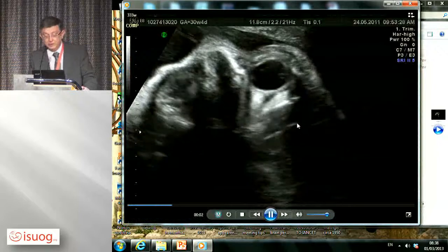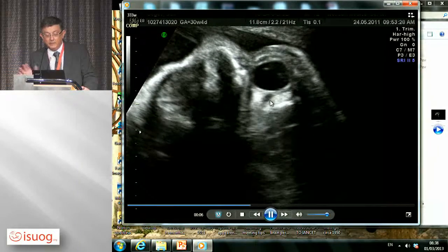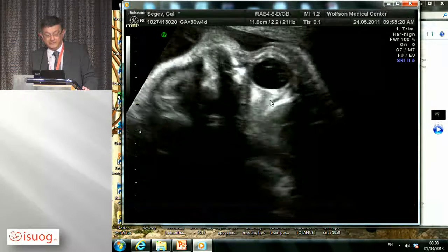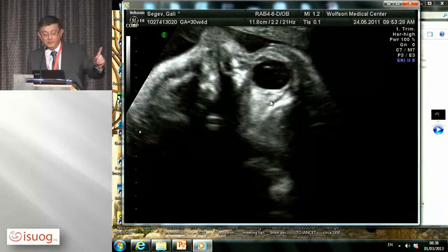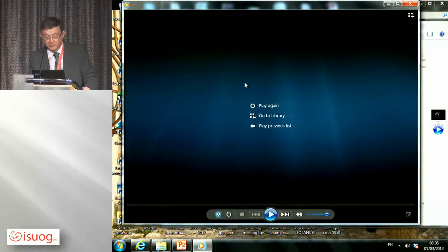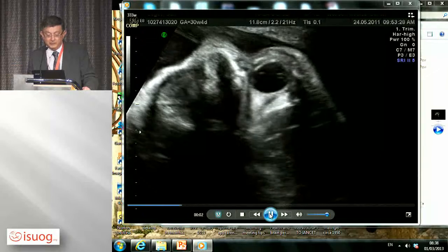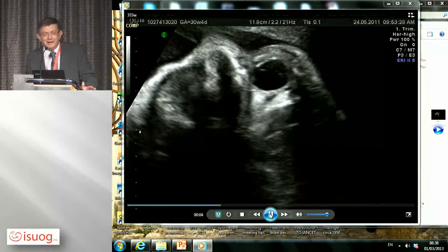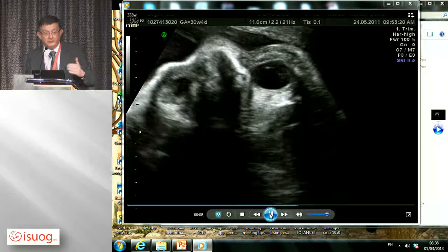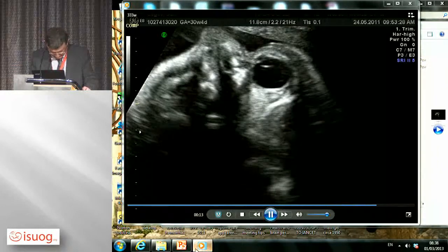More or less at the same time, we started looking at the fetus and we saw that something is moving beyond the eye, inside the retrobulbar fat. And this is this black line that moves from one side to the other. And being obstetricians, the first time we saw something moving there, I called our pediatric ophthalmologist and said, tell me, the optic nerve moves? And he said, sure it moves. It moves inside the fat. So we are looking there at the optic nerve.